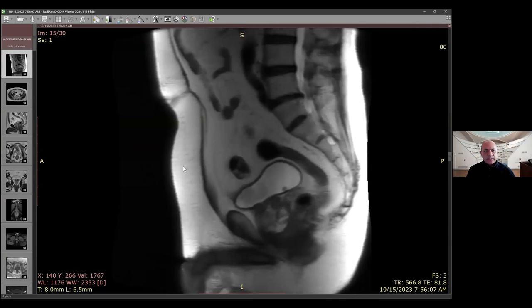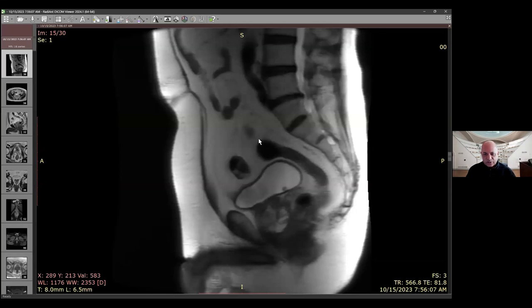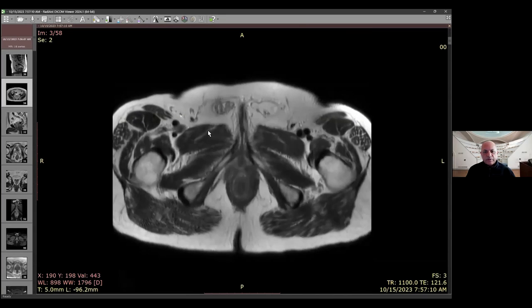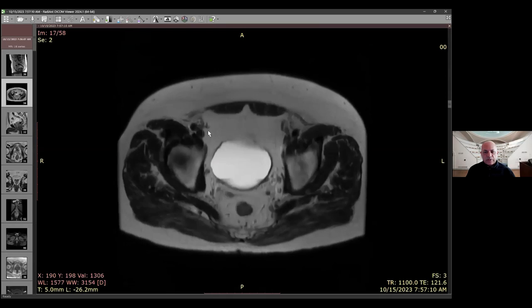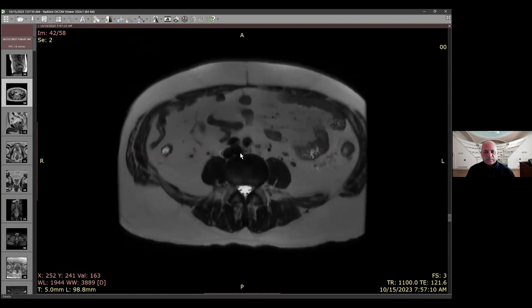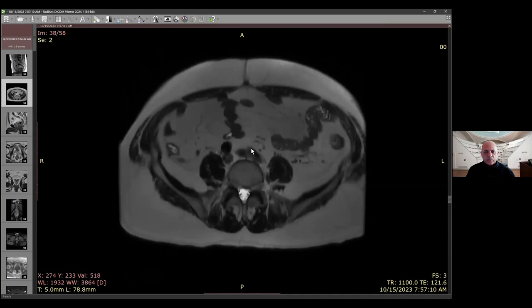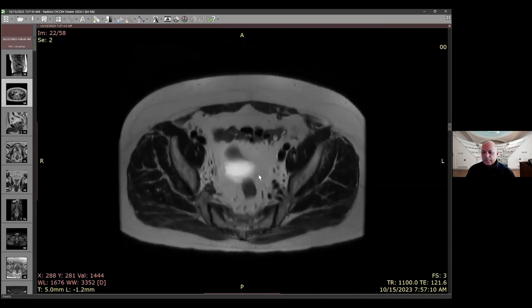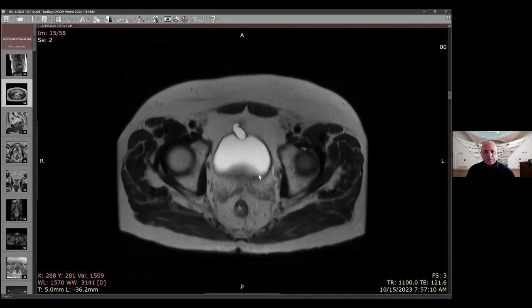You'd be surprised how many times with phased array coils, if one channel is malfunctioning, you may see signal loss in certain areas of the scout and the technologist can stop right there and figure out what's going on. We do a wide field of view T2 going all the way from the aortic bifurcation down to the level of the pubic symphysis. You can see we are coming up to the aortic bifurcation going down.